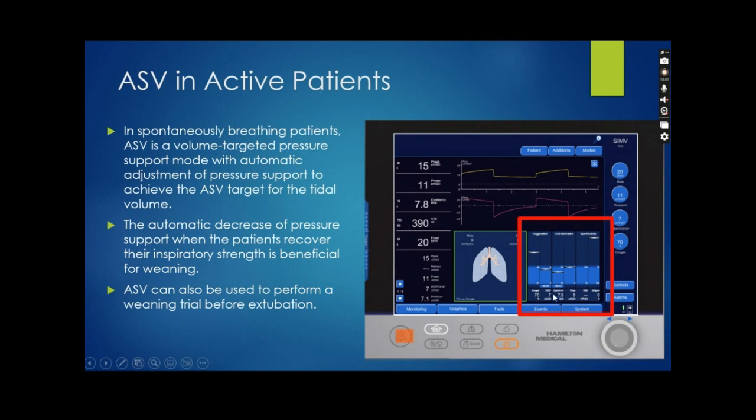And I know it's probably a little bit hard to see here. Their PEEP levels are lower. They're not requiring a lot of PEEP, below 8. Expiratory minute volume, now this is spontaneous as well as set by the ventilator. Your peak inspiratory pressure, that's an inspiratory pressure that's actually being delivered to the patient, so that pressure support being below 8, as well as your RSBI measurement and your effort percentage.